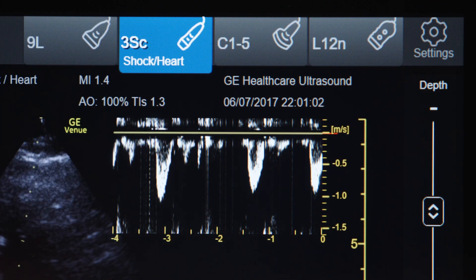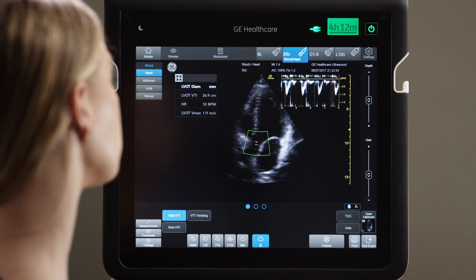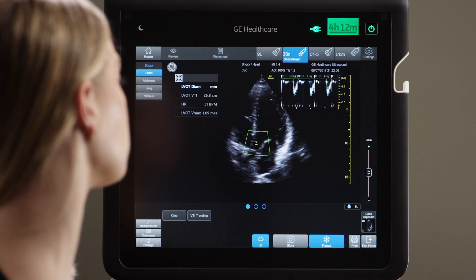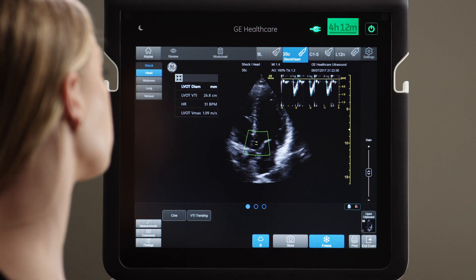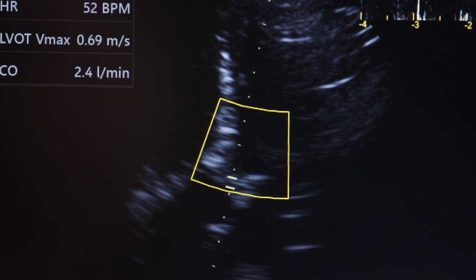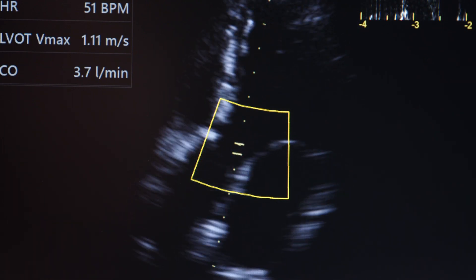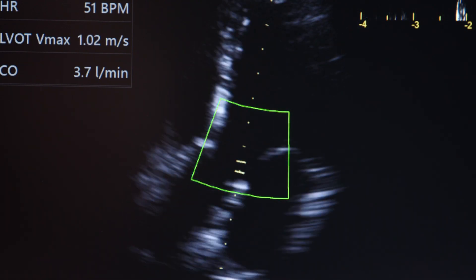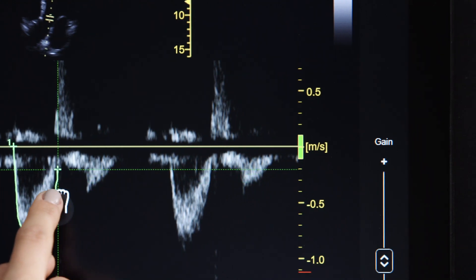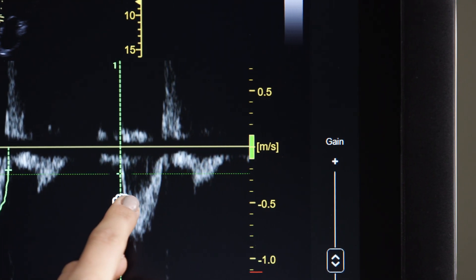With Auto VTI, Venue displays the Doppler signal automatically. The Auto VTI tool calculates the velocity time integral, or VTI, in a single step. The sample box changes colors, acting as a quality indicator to assist you with image acquisition. Without the Auto VTI tool, you would need to take several measurements and images to calculate the VTI.